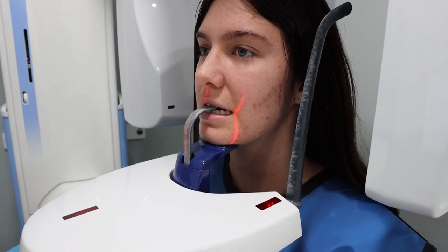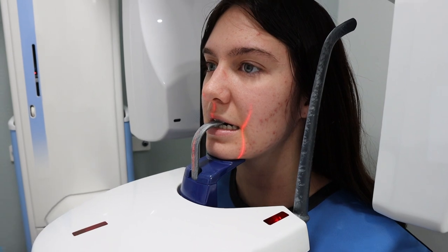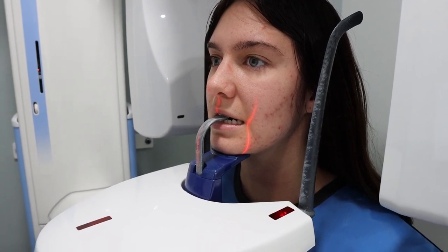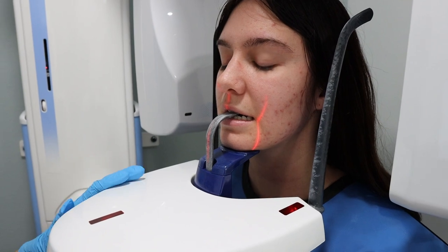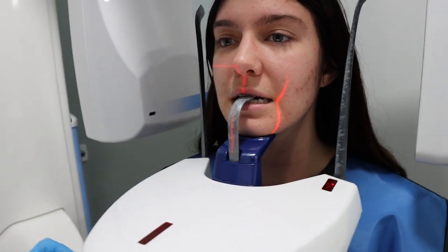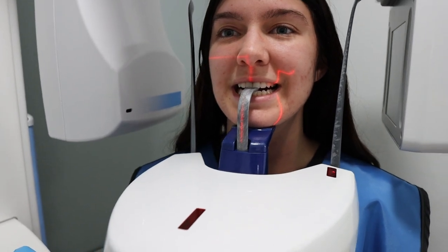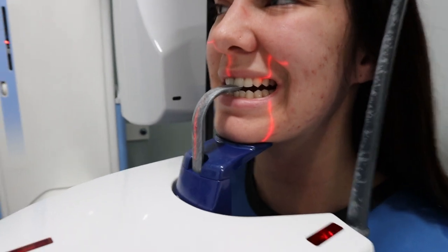Before taking the pano, you want to check that the patient's occlusal plane is parallel with the floor. You do not want the patient to be up too high or down too low. You also want to make sure the lasers — the middle one — is right in the center of the midline, and the one on the side is distal to the canine.